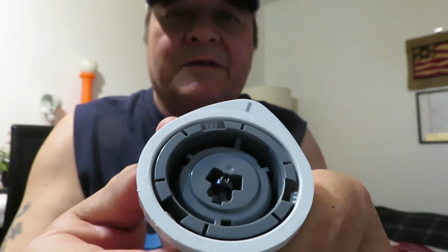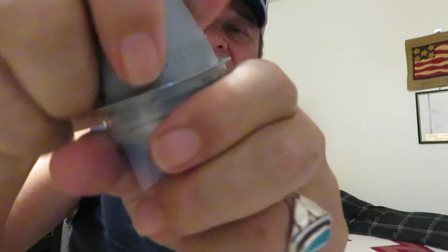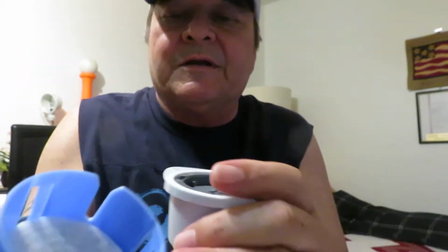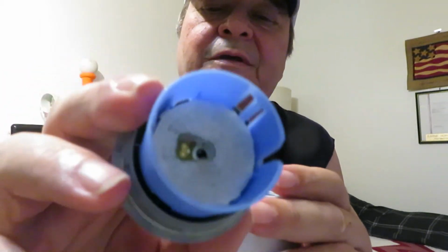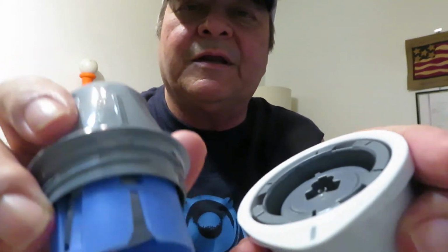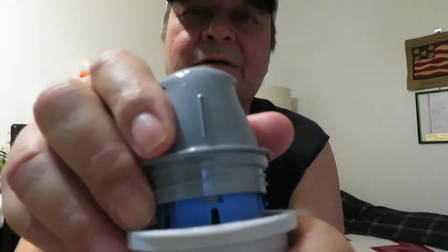There's the inside of that. You can't see anything. Then here's that part. Just twist it off. Not that hard. Last time I was twisting it the wrong way. Wasn't really sure. And then there's a little line right there. And then here's the inside of that. You can't see anything. Oh, that's the sticky part that goes on there, and it'll go on easy. And there's the line there. It'll match up to that line there. Should. And it does. See?